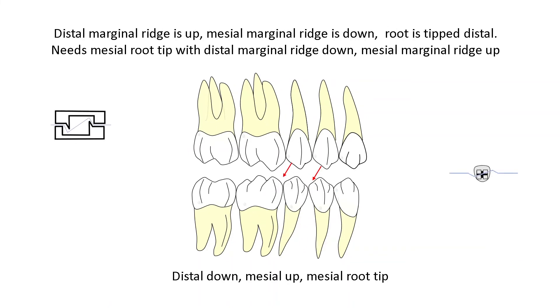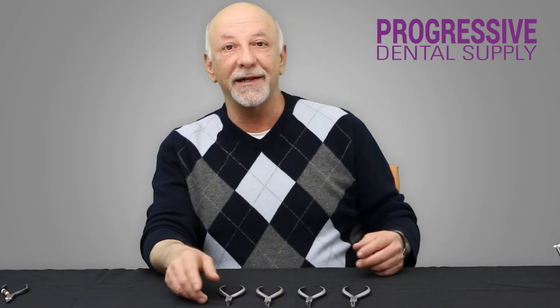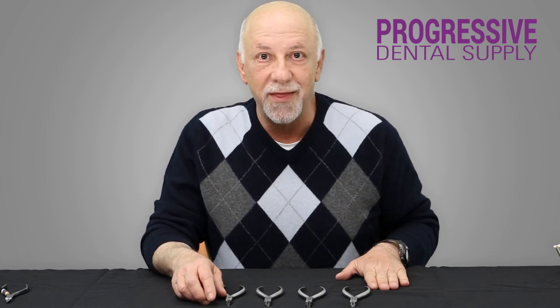We are talking about one tooth, and we can have six different combination bends that need to be created. We now have a set of four pliers that will enable us to create any combination of second order bend, keep them within the same plane, make the work easy and simplified, and save us a tremendous amount of chair time. I am sure you will find this set of pliers extremely useful, very helpful, and a major time saver. Thank you so much.